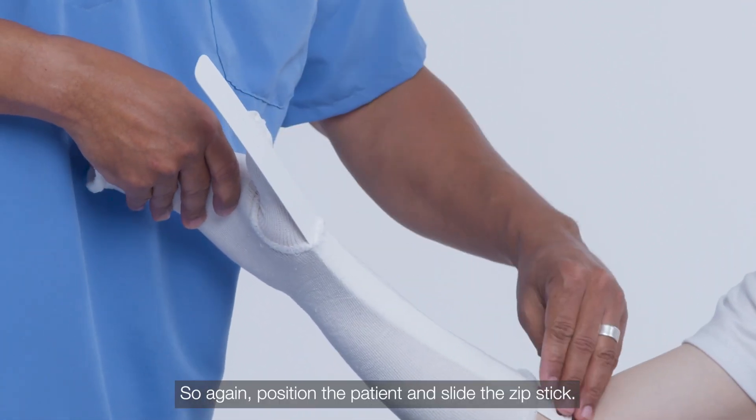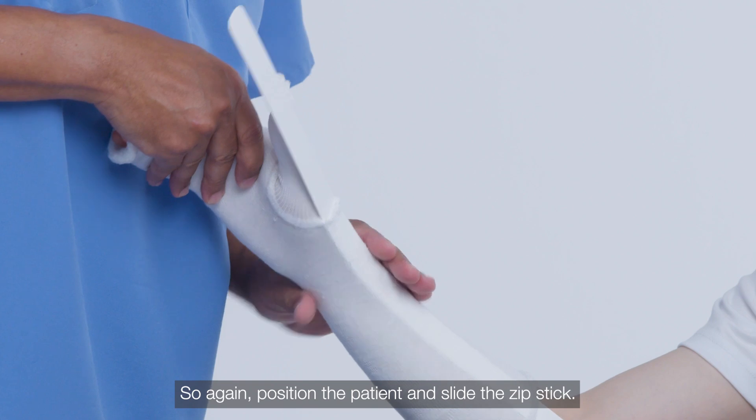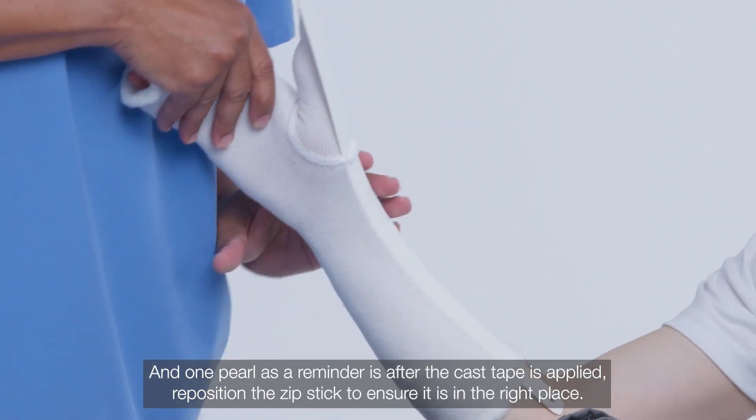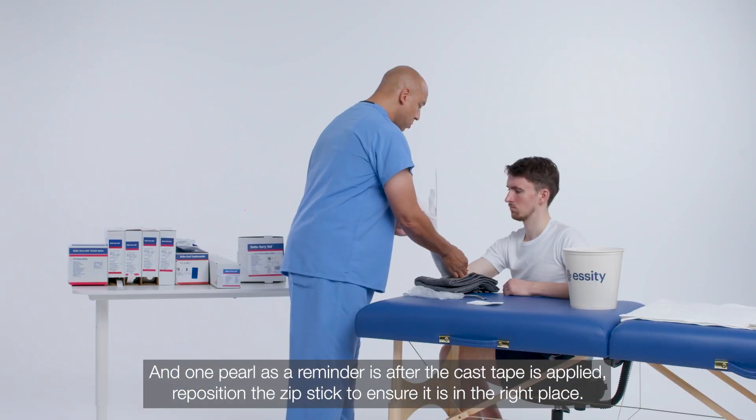Position the patient and slide the zip stick. One pearl as a reminder: after the cast tape is applied, reposition the zip stick to ensure it is in the right place.